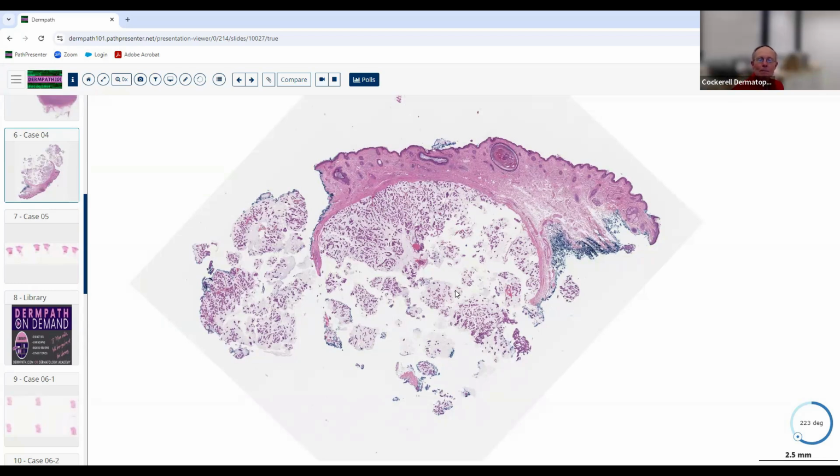Initially they look like epithelial cells to me. They do, these epithelioid cells kind of nested together. And then what about this stuff over here? It looked more like mucin deposition there. Good. Yeah, it's kind of whitish, grayish, so it's got some pallor to it. And then it's got these small aggregations of cells that seem to be floating in that at low power. So that's helpful if you can recognize that at low power.